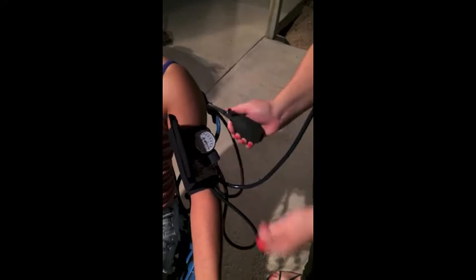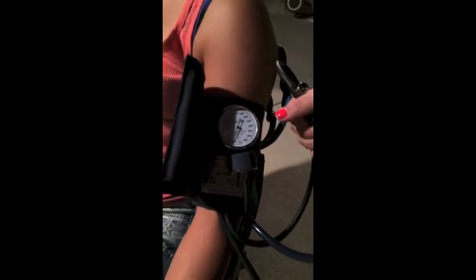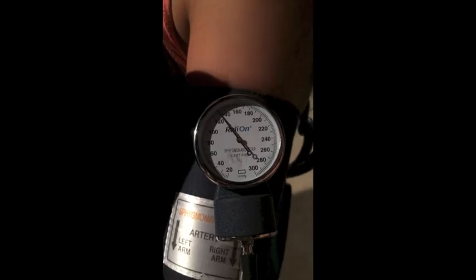Watch the gauge and keep inflating the cuff until it reads about 200–220 mmHg. At this point you should no longer hear the pulse in the stethoscope. Slowly release the pressure by opening the air valve to the left. Listen carefully for the first pulse sound — as soon as you hear it, note the reading on the gauge. This is your systolic pressure, which is the force of blood against the artery walls during your heartbeat.